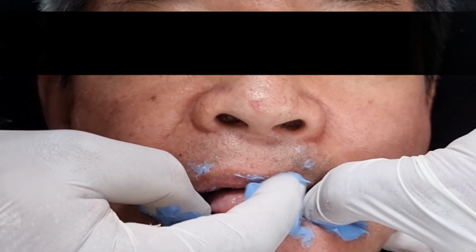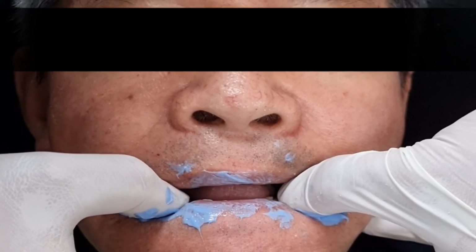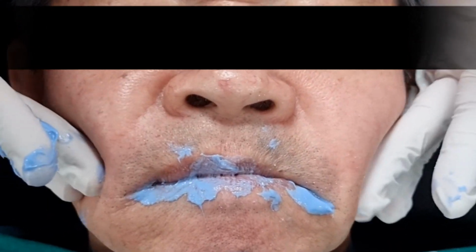Slight opening and touch the upper lip with the tongue. Avoid excessive opening to prevent distortion.